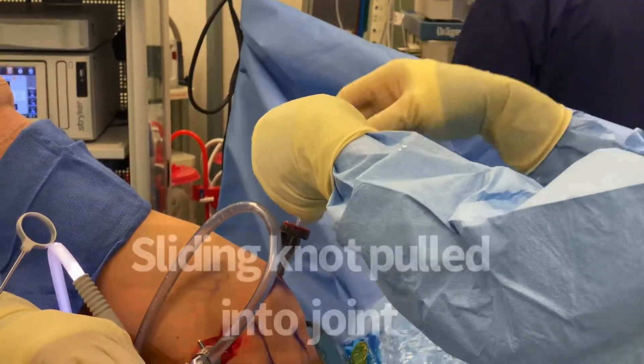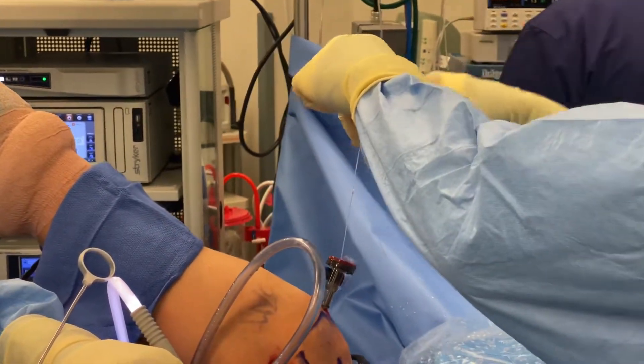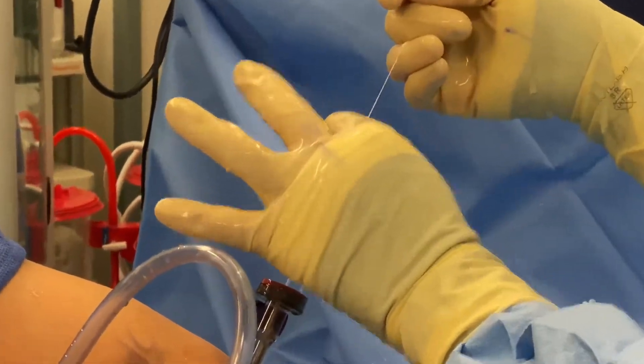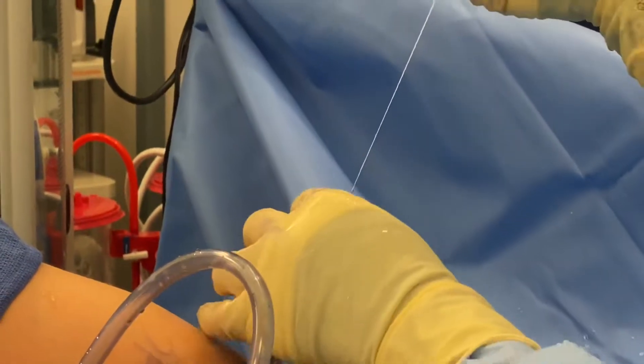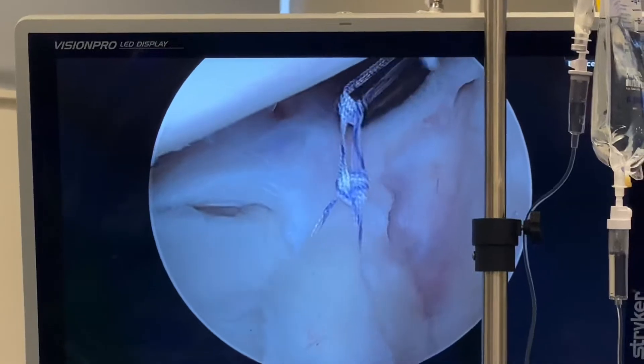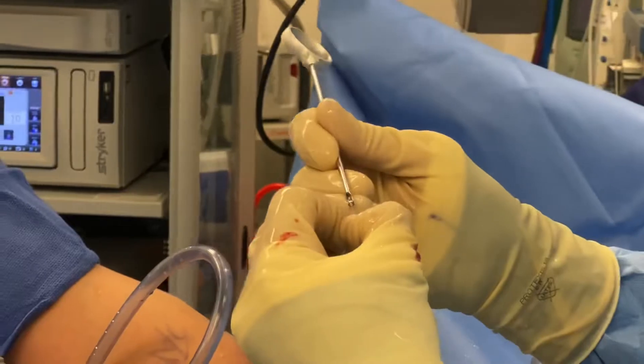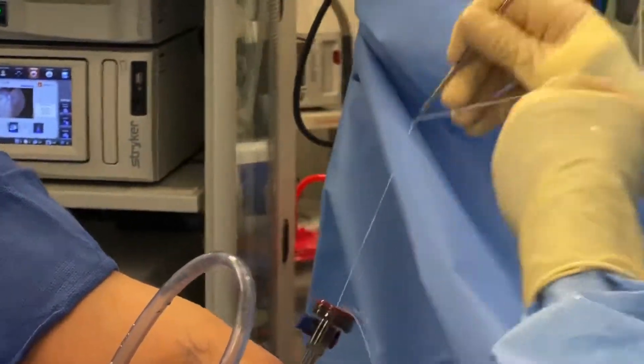So I'm going to tie knots — it's called a sliding knot. The knot is tied outside of the patient and then pulled in. You can see there's a knot coming in — sliding knot — and the knot pusher is used.